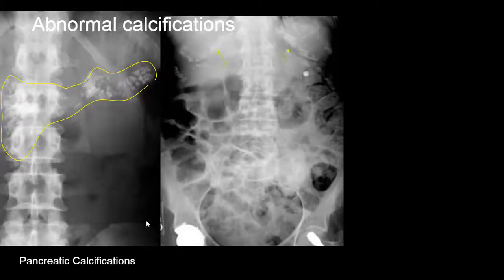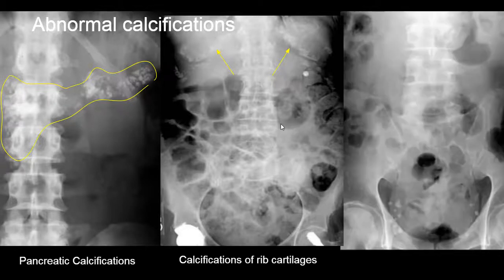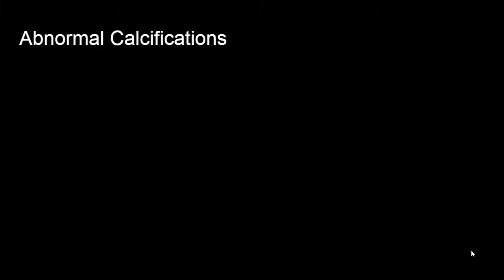Here are some more abnormal calcifications. Along the costochondral cartilage — this is not really abnormal since we see this in normal older patients when the costochondral cartilage calcifies. In the pelvis we see a pattern specific for phleboliths, which are calcifications within veins and occur in normal individuals.